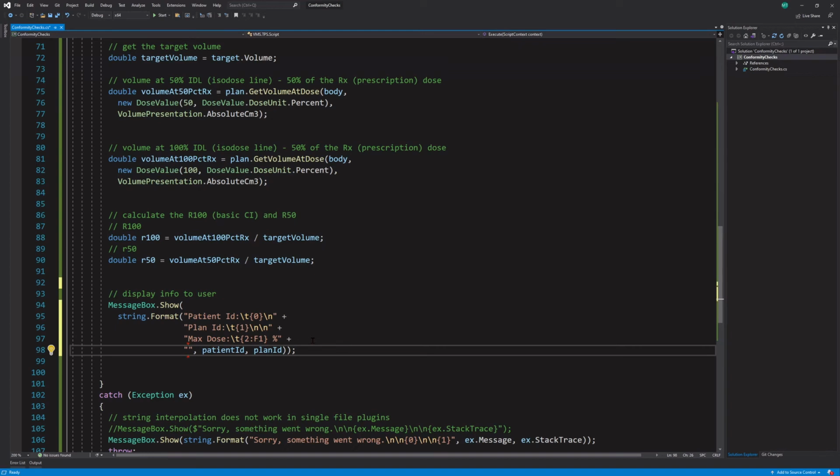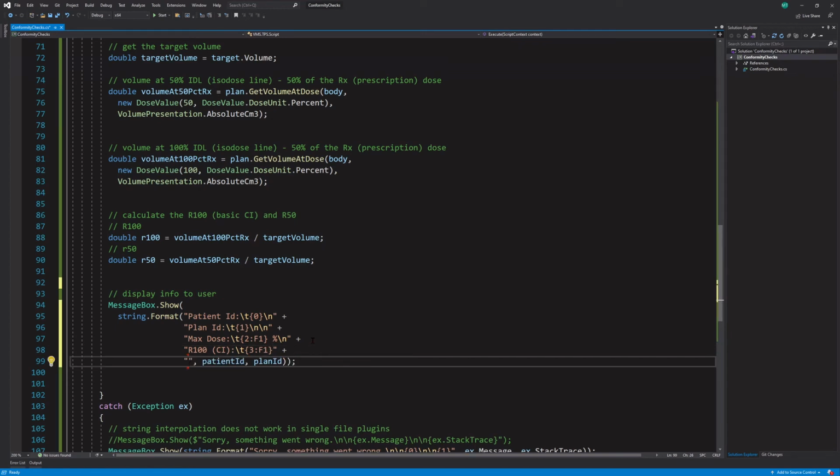And then let's say the R100 CI, and let's tab that over. Oh, we need to add our new line, so we didn't do that. Okay, and then let's tab, and then let's add our, so this is the third position, and we know we need to format this. This is in absolute volume. Well, no, it's R100. Let's just do 1 decimal place for that. And then we'll do the R50.